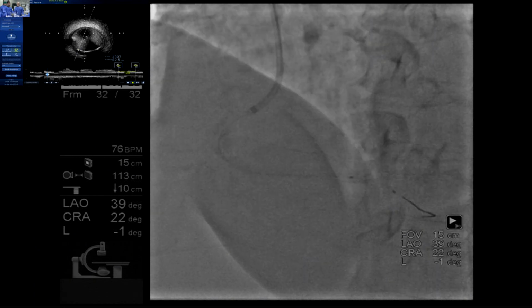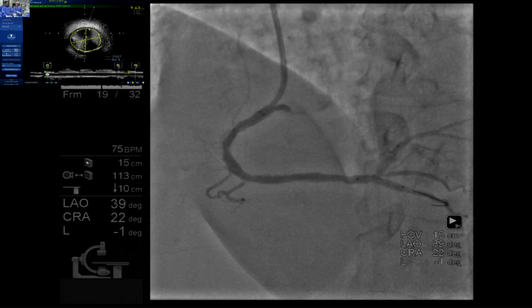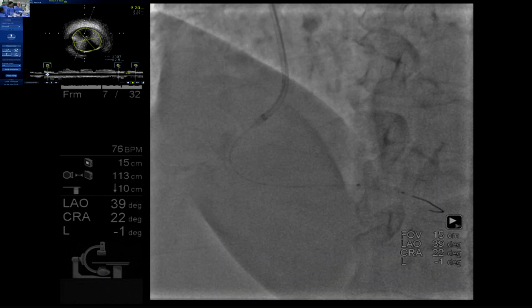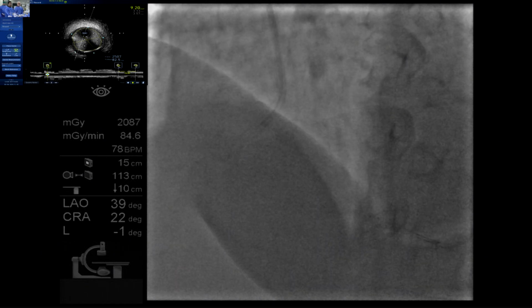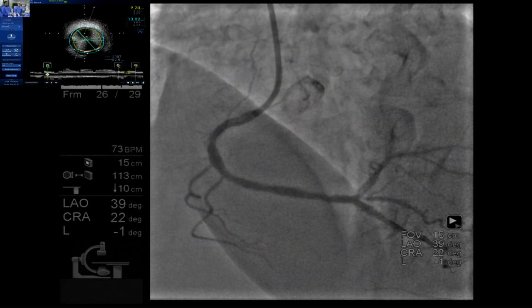You think we can go here? No, negative residual distally. Even proximal, it's not good. So go here at around 15, okay, and then that should be okay. 15, this becomes 3.21. Record and deflate. What do you think about the expansion, apposition, and all these things? Looks good, lovely. And you saw all the branches are very well protected.